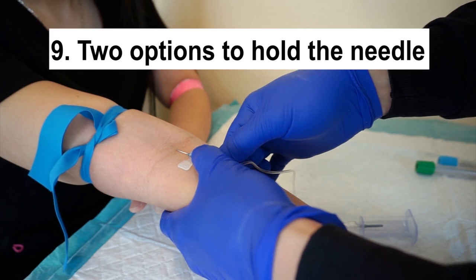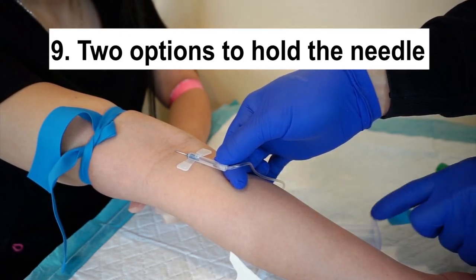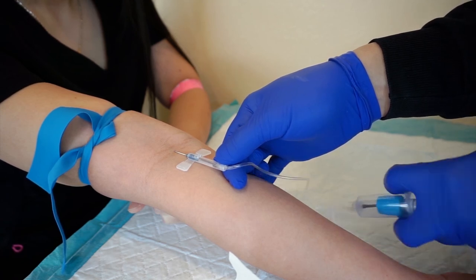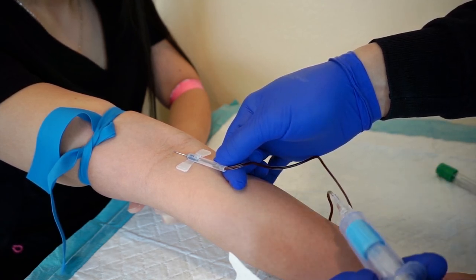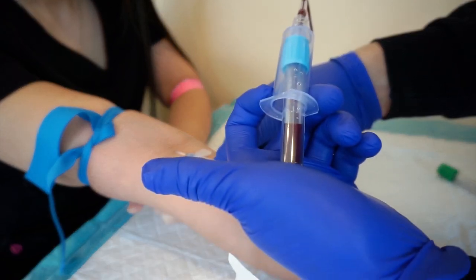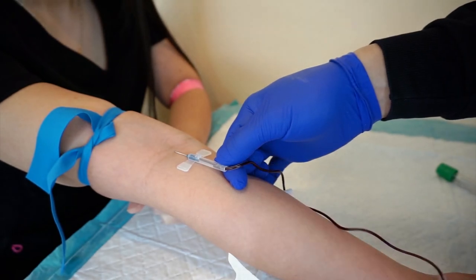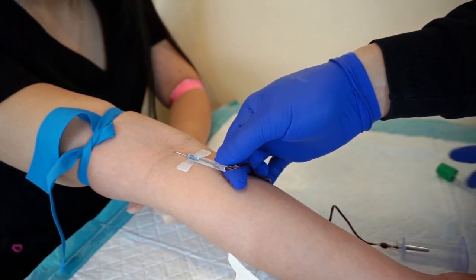Nine, for a butterfly, you have two options. First, let the needle go once you insert it and hold onto the hub as you exchange and fill up each tube. The other option is to keep holding the needle and the hub in a similar manner as a straight needle draw, using the other hand to exchange the tube.